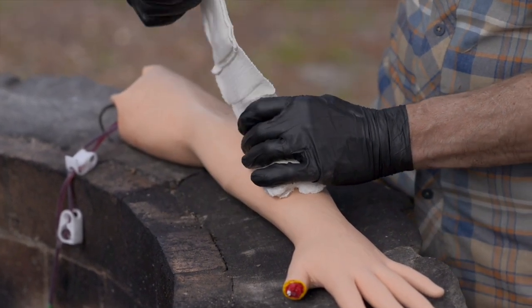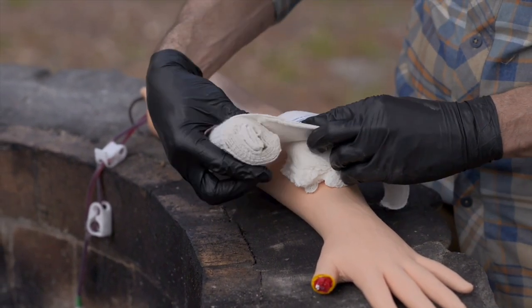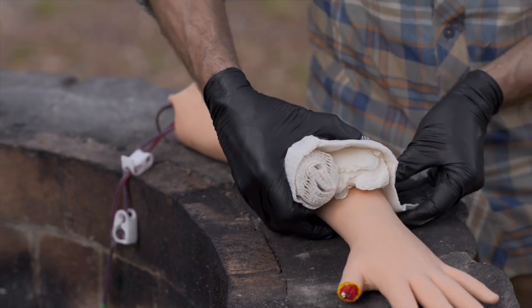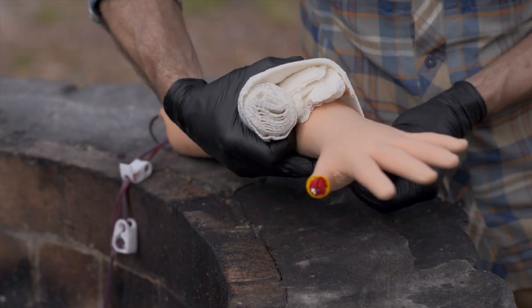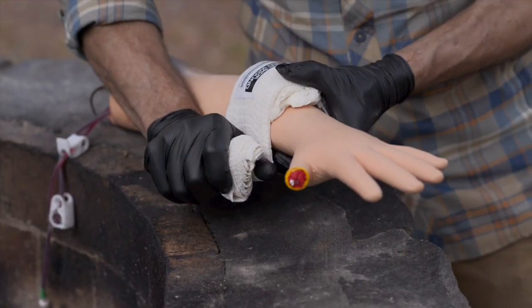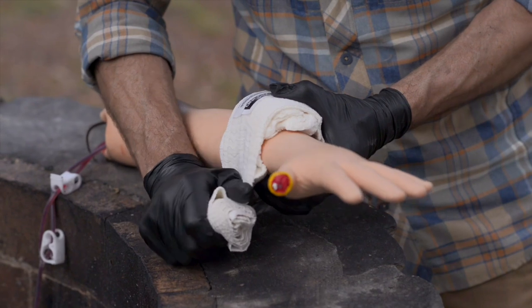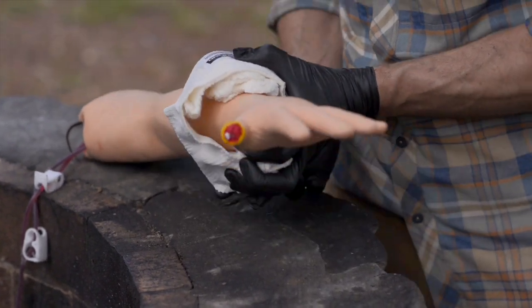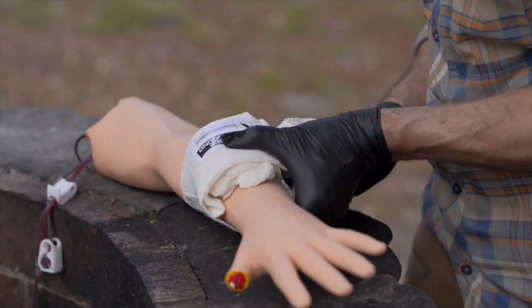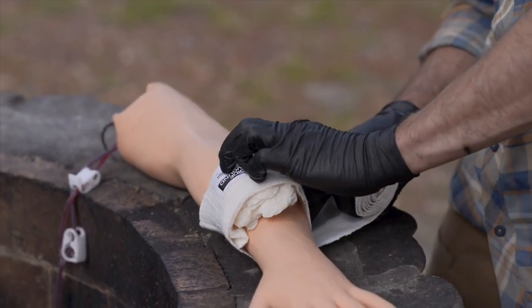You've still got your dressing. That dressing goes directly over. Pull this under. And then replace the pressure that you had on with your thumb with pressure on the dressing. Get that to capture. It's got some Velcro underneath here.